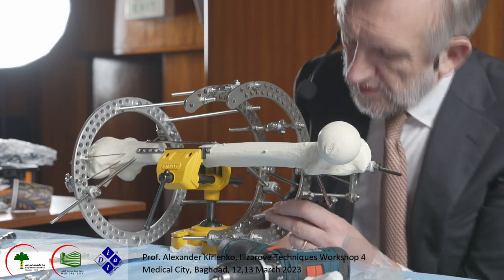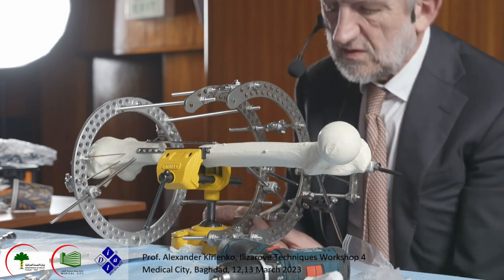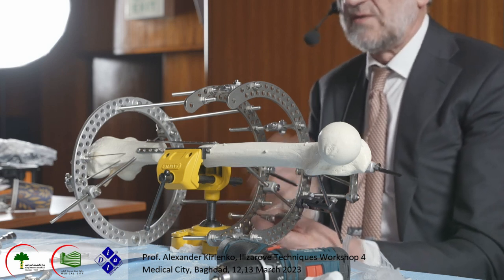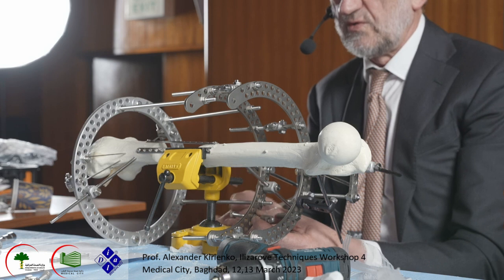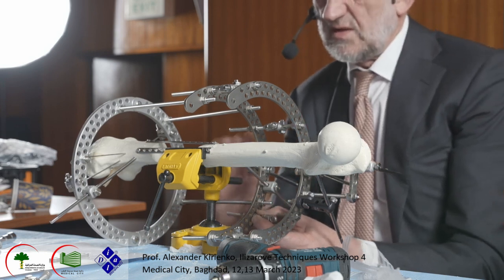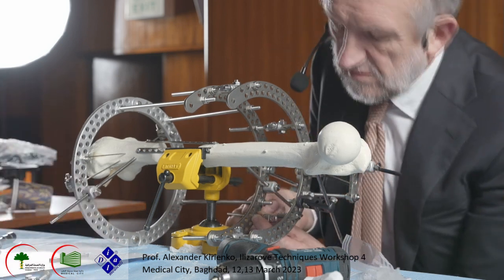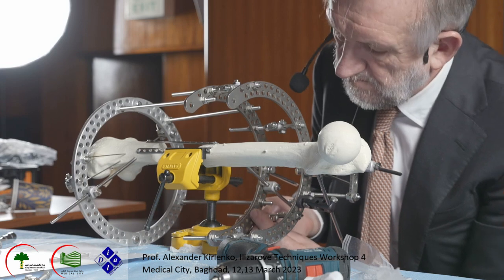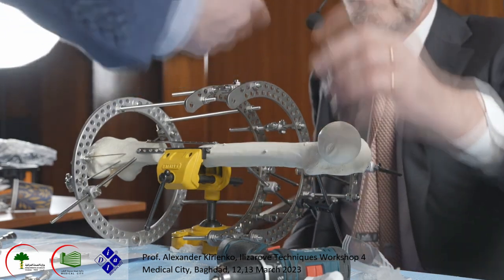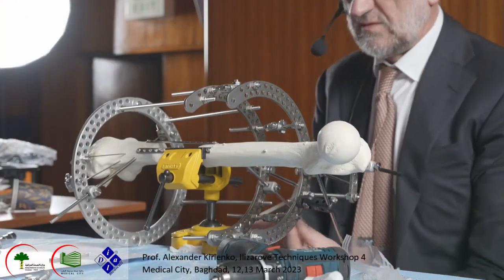When you build biplanar hinges, always do this system of attachment. First, they put the post, like a two-hole post, for example, the first step. The second step, put this rod with the female. And the third step, put the male again to connect them between them here.